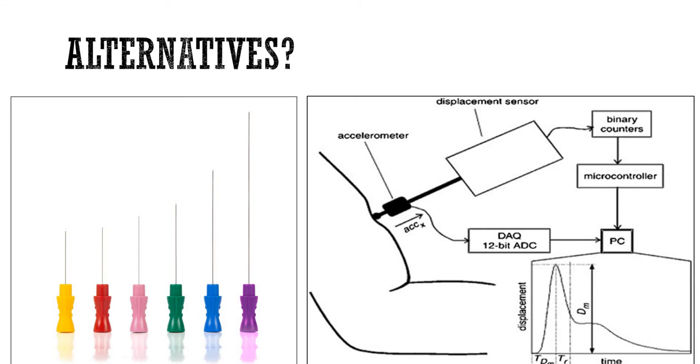Okay, so are there any alternatives to surface electromyography? Yes, there are. Obviously, I wouldn't have put the slide on. And this is just a possible area of recommended reading for one of these techniques, because obviously there are some strengths and limitations that come with surface electromyography, but these two techniques that we have here represented graphically will certainly help overcome some of those, but they themselves come with their own alternatives.